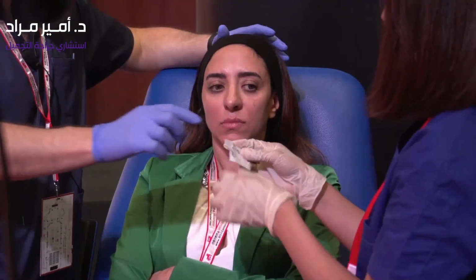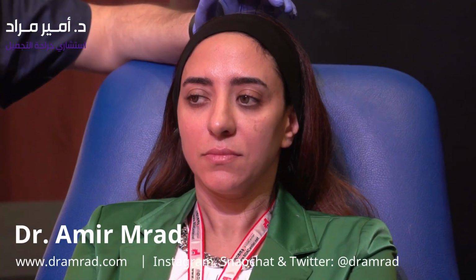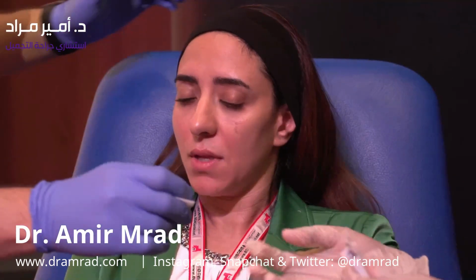So, you're usually going around your patient because you're looking from every angle. Every angle, for sure. Sometimes even from the back, and you look at the cheeks. It's very important to assess the face while you're injecting, not just at the beginning.